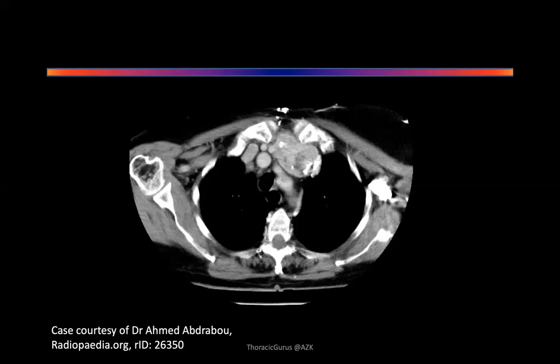Is it a cystic mass? Let me ask you this question again. No, it's not a cystic mass. It's a multilobulated mass. It is heterogeneous. Homogeneous means everything is the same. This is heterogeneous. Yeah, right. What else can you see? With some calcification internally as well as at the margins, peripheral calcification.